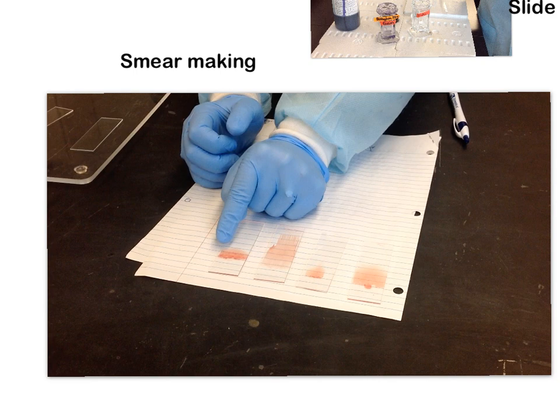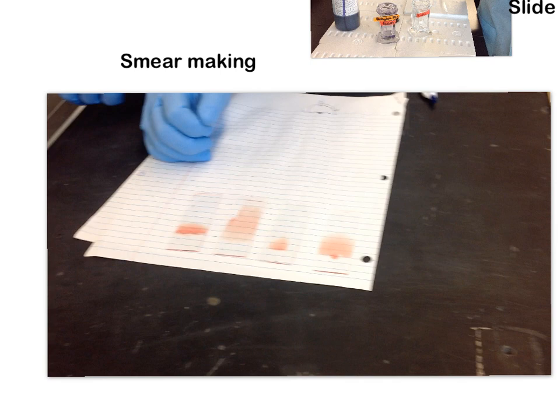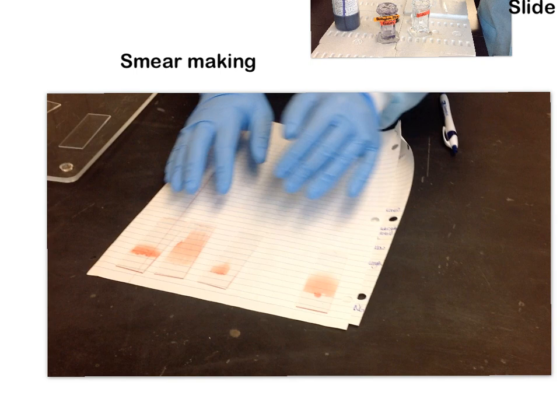This is also a really bad example. You can see there are little particles stuck inside the smear — this was made using way too much pressure. The pressure chipped off pieces of the spreader slide, so these are actually tiny chips of glass embedded into the slide. This will burst open cells and make it very difficult to get an accurate representation of what the blood looks like.